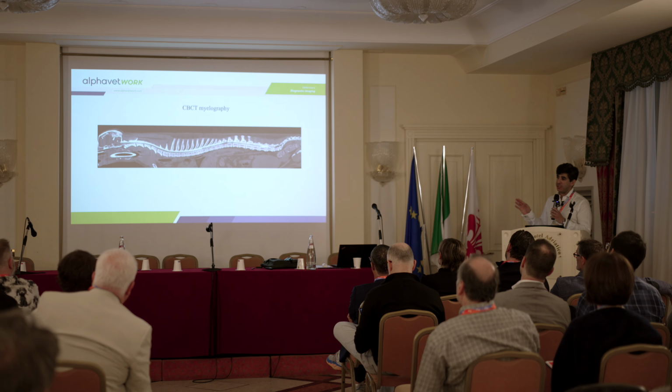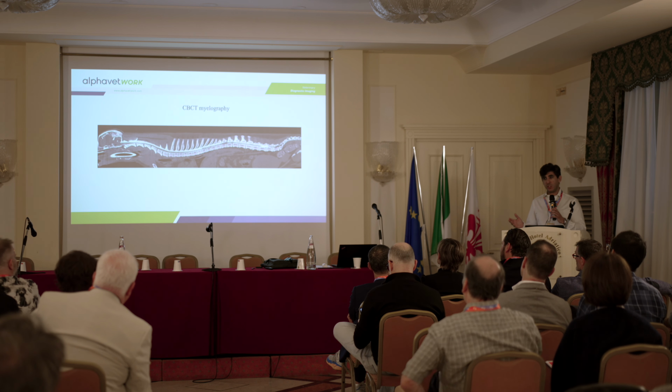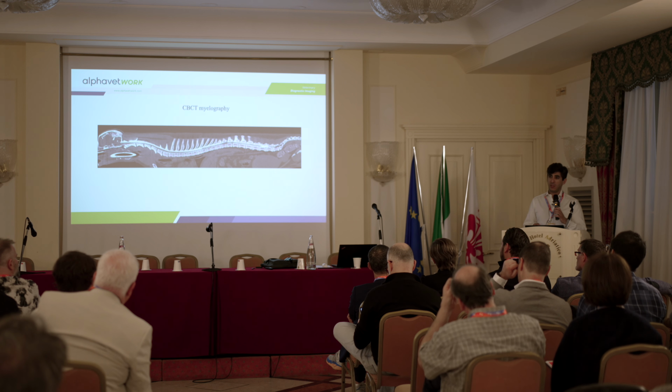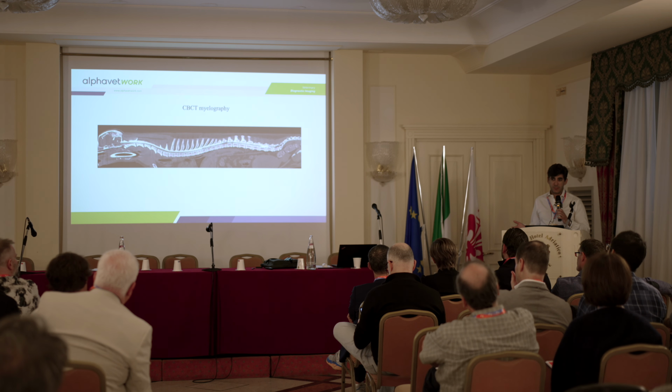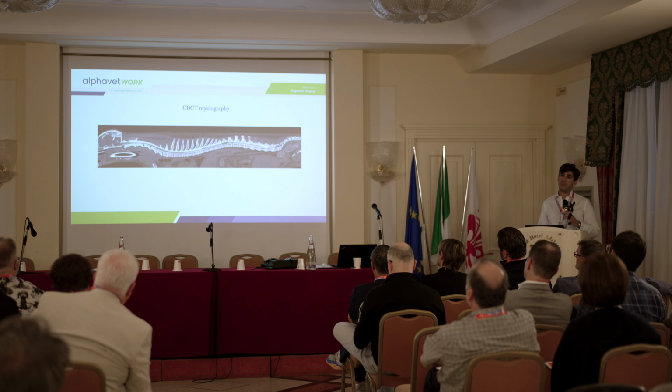Dr. Kuka will go deep into the CT myelography, but with the colleagues that have the CBCT, I tell them, if you do the spine, sometimes we have artifacts in the IVD space. If you combine it with a myelo-CT, you rule out all the surgical cases. What you cannot rule out is infarcts, but that's not surgical. So, in my opinion, in daily practice for the vertebral column, if you want to see if it's surgical or not, CBCT is more than enough.